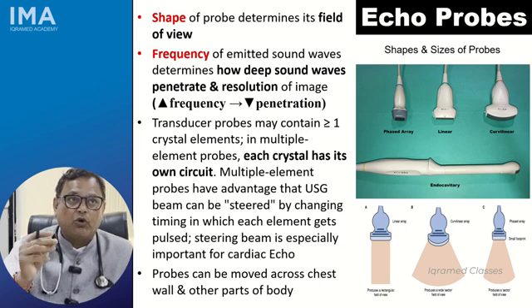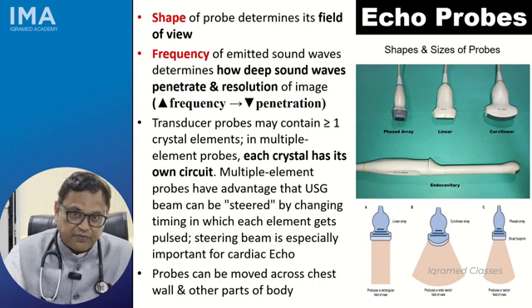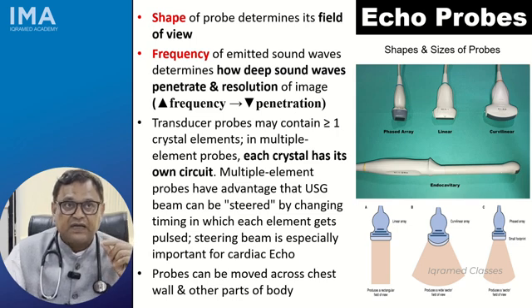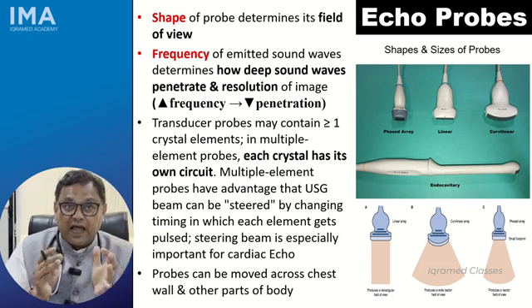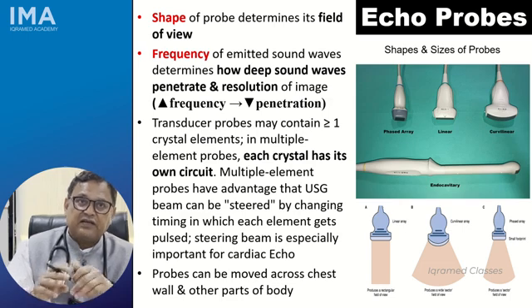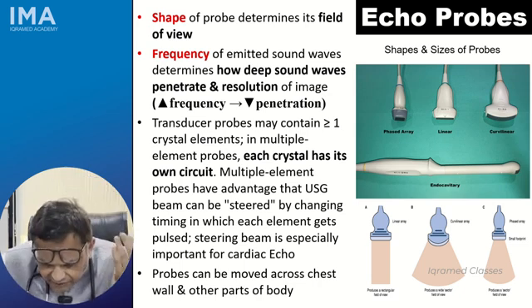So this is how the probes look, and inside it, as you already know the structure, there will be a piezoelectric crystal, an acoustic insulation, and a lens positioned in front of it, which will also allow good transmission. So everything will be there in the probe, but probes come in different shapes, and also different types of probes are there. There can be a linear probe which only gives linear energy. There could be a semicircular probe, or you can say a curvilinear probe.